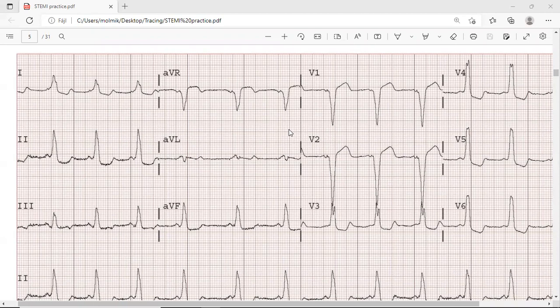Now another thing, for example, left bundle branch block. Left bundle branch block can cause a QS complex in the anterior leads. Yes, but left bundle branch block can also be due to MI. When you have ischemic changes of certain vessels that supply the bundles, that can block as well. So this way you have two things. This is why they say that if the patient has, for example, the typical sign of MI, such as angina, plus the patient never had left bundle branch block and now you see the sign of left bundle branch block, you have to assume that the patient has MI, okay?